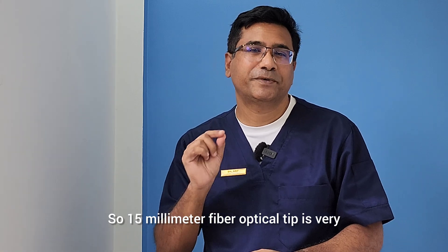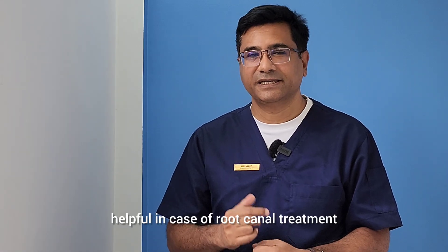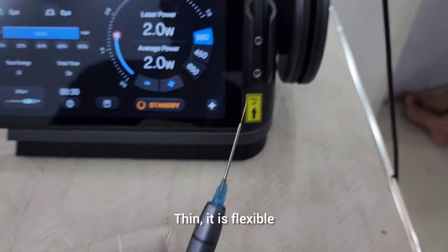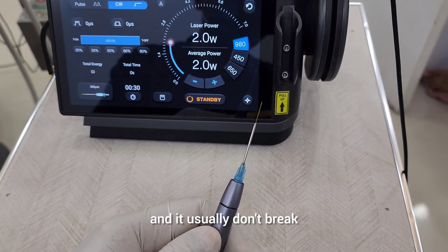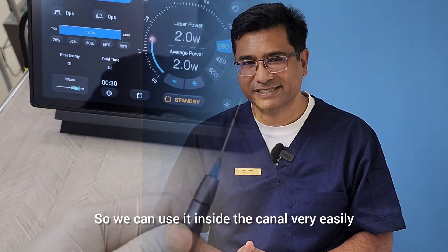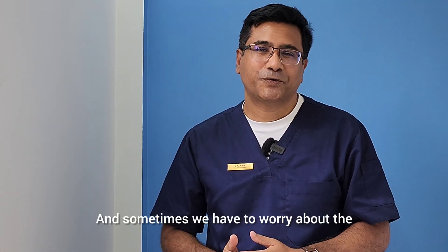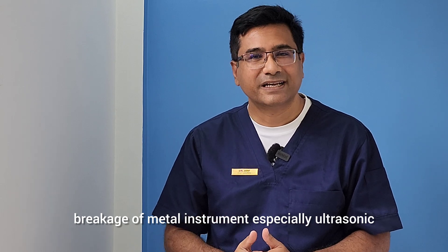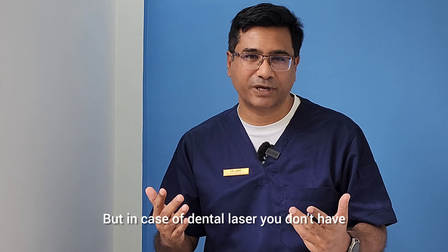The 15 millimeter fiber optical tip is very helpful in root canal treatment because it is very thin, flexible, and usually doesn't break. We can use it inside the canal very easily. Sometimes we have to worry about the breakage of metal instruments, especially ultrasonic activators during root canal treatment, but with dental laser you don't have to worry about that.